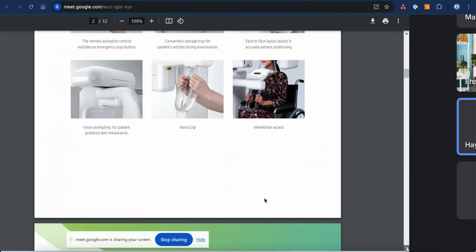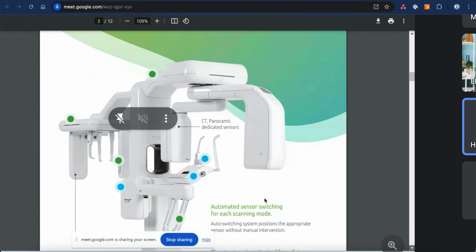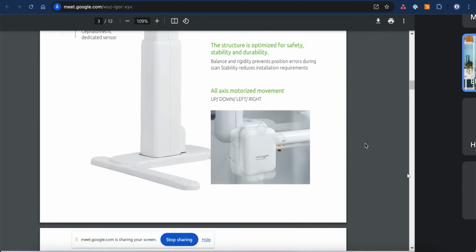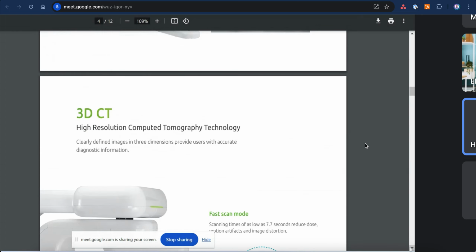Okay, now I'll get to it. Yes, can you see this part? Yeah. Okay, this one here is for cephalo. But this one here is for CT, which is the CBCT and the panorama. The cephalo has its own sensor, while the panorama and the CBCT has another sensor, different completely. And this device is so flexible, like it can move in all directions, which is amazing.